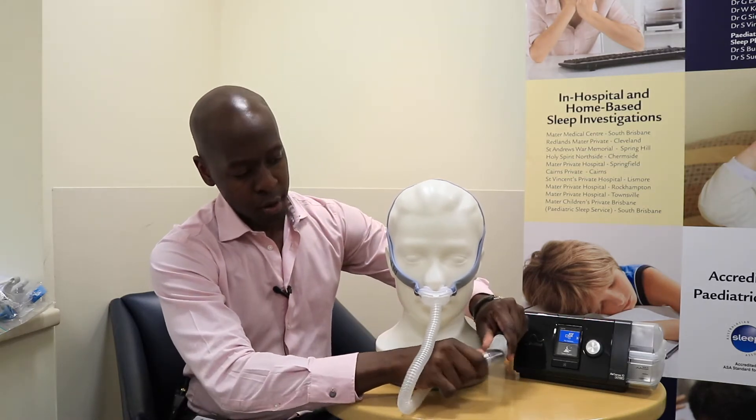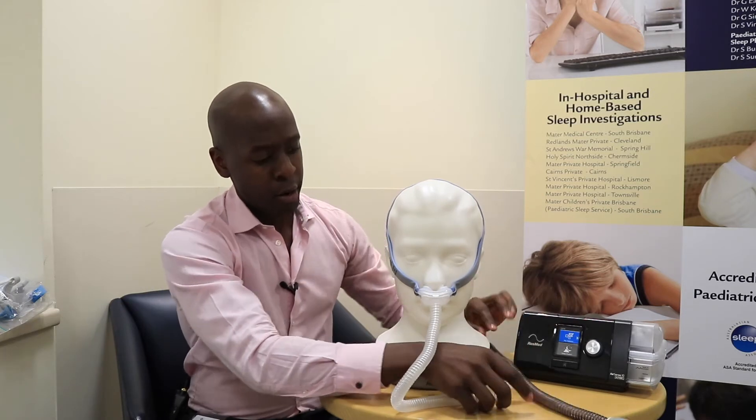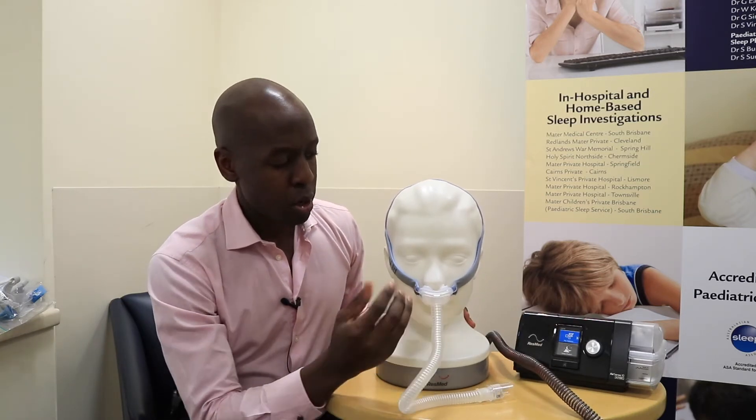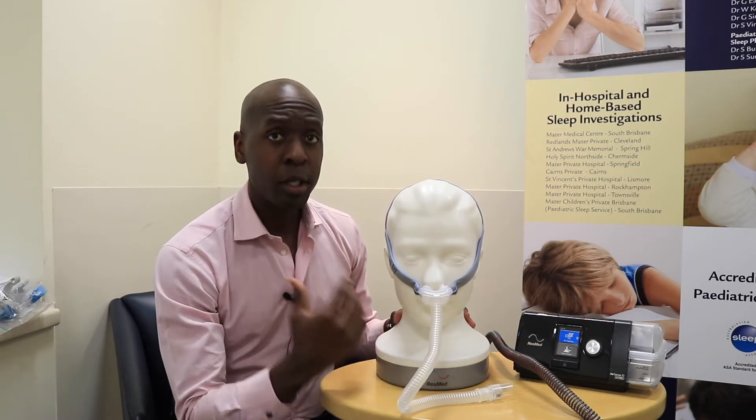To do that, just remove the tubing and head over to the mirror and just make sure that the nasal pillows are sitting nice and comfortably in the nostrils.